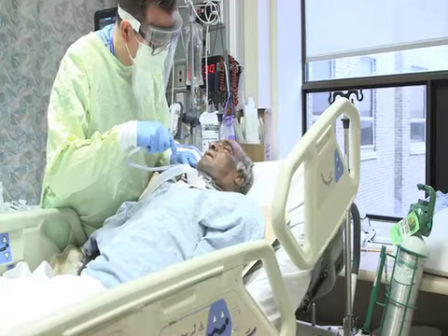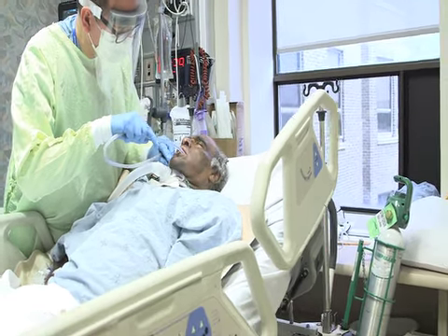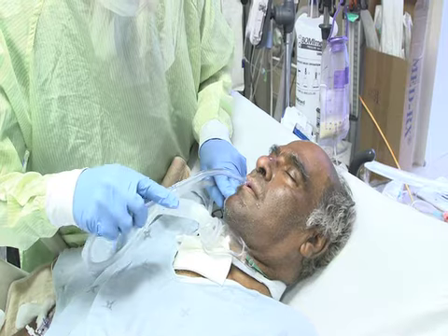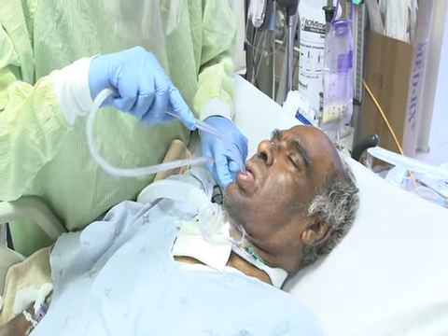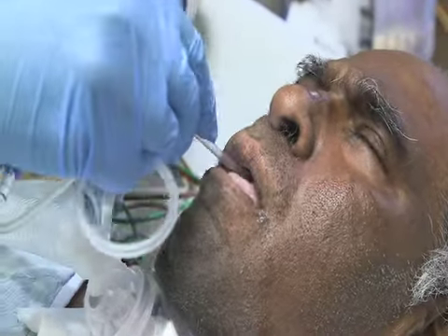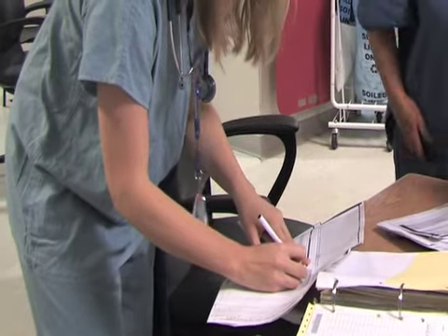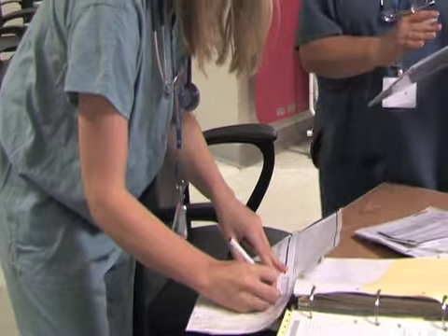Oral and subglottic suctioning is recommended as the last step to oral care while taking into consideration the amount of secretion production. Suctioning can minimize aspiration of contaminated secretions into the lungs. Gently insert the suction device along the side of the patient's mouth into the oropharynx and advance to reach the subglottic space. Suction the accessible secretions. Suction for only 5 to 10 seconds to avoid direct contact with the oral mucosa. At the completion of comprehensive oral care, make sure to document the procedure and report any abnormal findings.